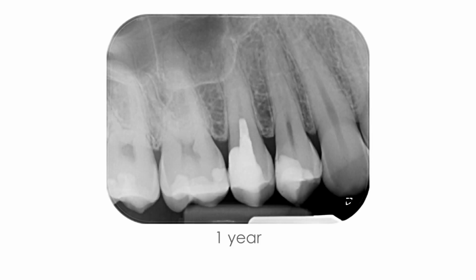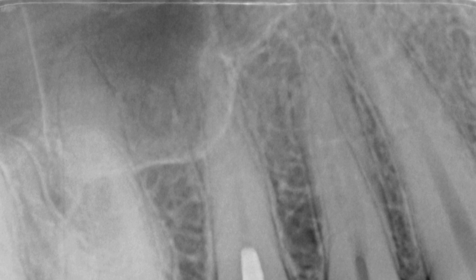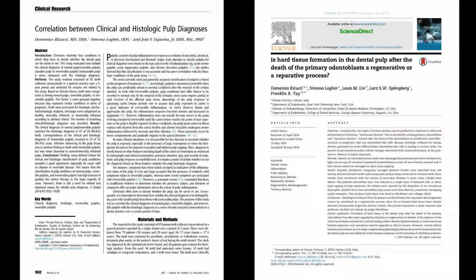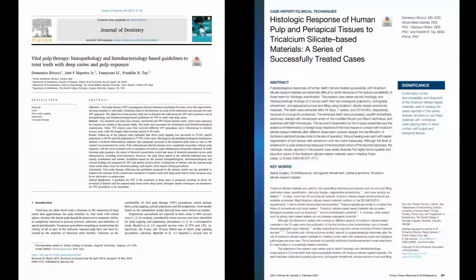At the 1-year follow-up, the radiograph shows normal periapical tissues and some mineralization at the deeper pulpotomy surface. Sensitivity tests are not reliable because the pulp wounds are located below the cervical region. The clinical treatments shown in this video are based on the following publications.